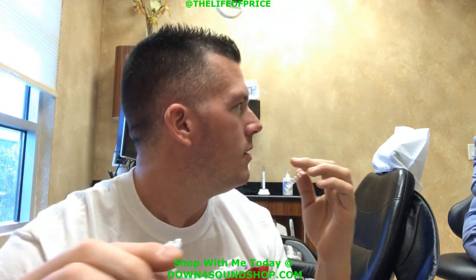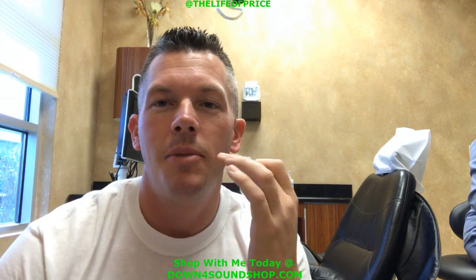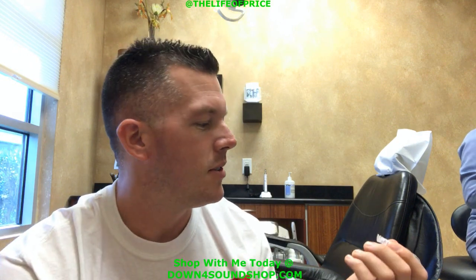She said right now I don't have the attachments on. Some of my teeth are going to need attachments because, if you've seen my Instagram or Facebook videos, some of them have to turn almost 180 degrees, like the ones on the sides. They have to turn a lot, so they put the attachments on so it has more to grab onto. But anyway, which one do I put on first, the bottom or the top?